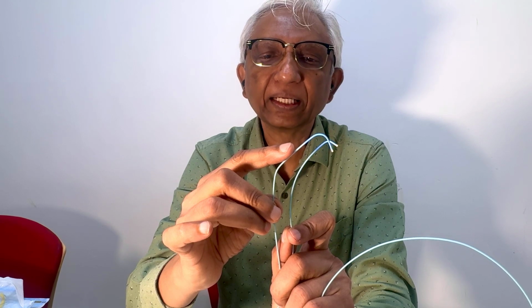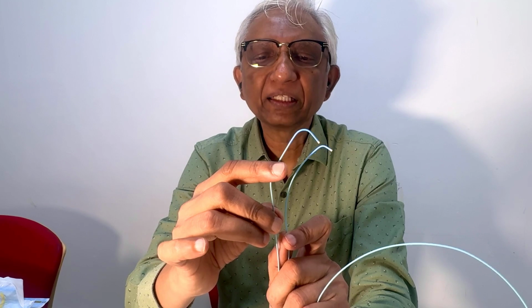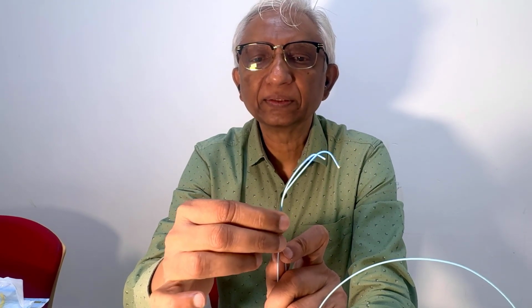Okay, have you got it? It will go inside this way. So it's a good catheter, but one of the challenges with these catheters is that when you inject very hard, it will pop out. So sometimes you'll get out of the ostium, but it's a common catheter that you can use and can be used for renal arteries.